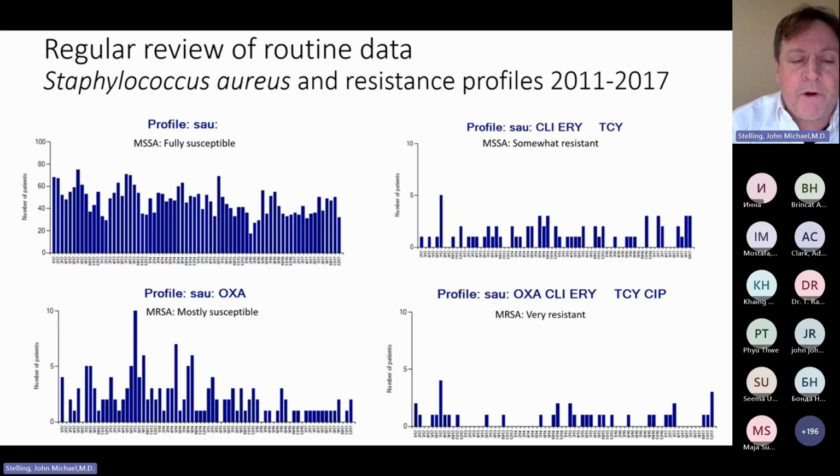In the beginning, you see a very large peak with 10 people with MRSA in this time period, and that looks like a potential outbreak. Is this an outbreak? I do not know, but I think it might be an outbreak, therefore it merits further investigation. Maybe there's a contamination issue, maybe there's a quality issue, maybe they are simply doing more MRSA screening.